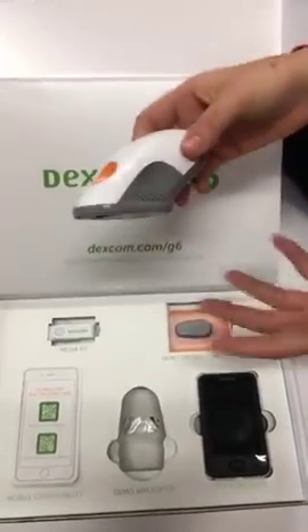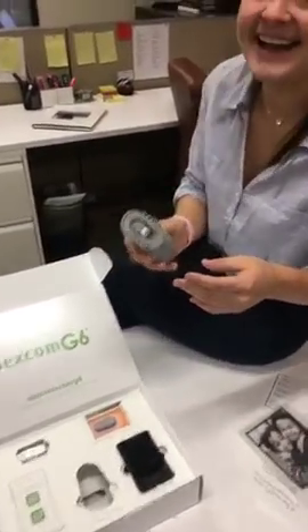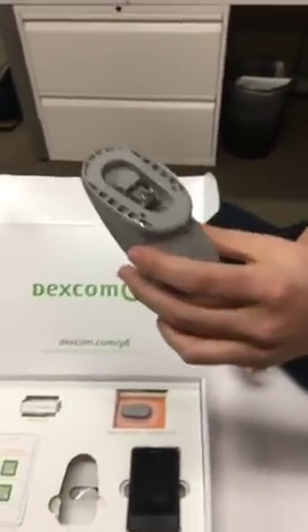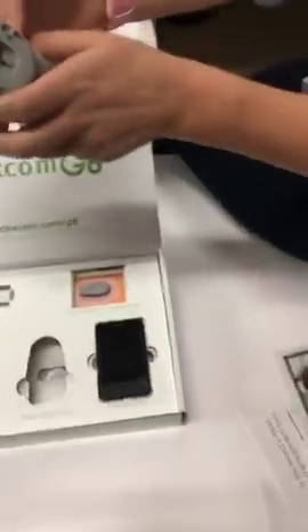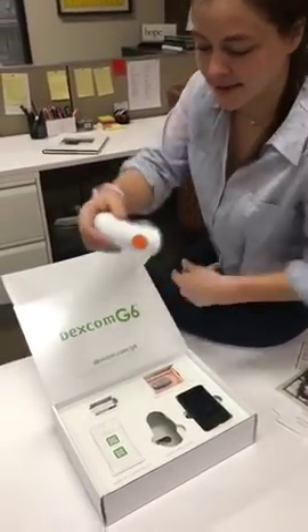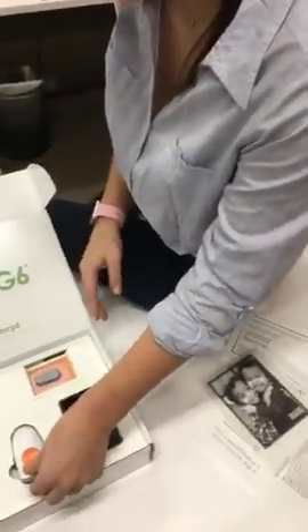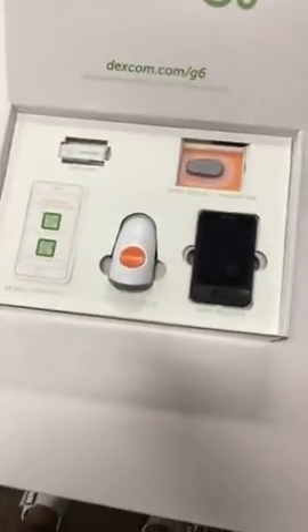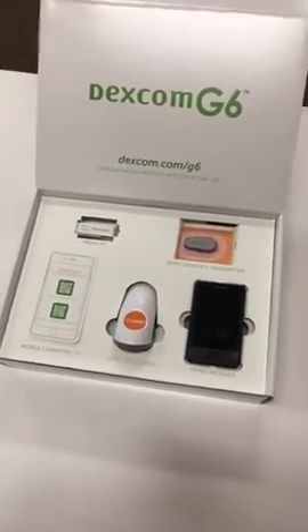This is the new applicator. If you've been a Dexcom user, you know how big, painful, and unwieldy those applicators can be — I like to call the current G5 applicator the 'harpoon.' This new one is a total game changer: you just press it with one hand to put the sensor in. There's no more pushing and pulling and breaking things off. It's really going to help for one-handed applications, whether you're putting it on your arm, or for little kids who might be scared of needles.